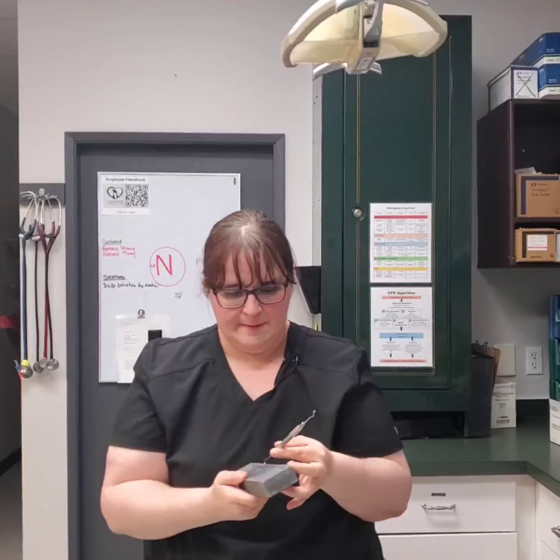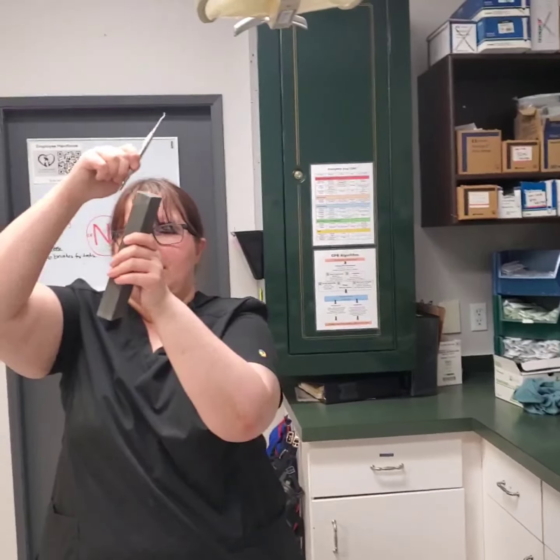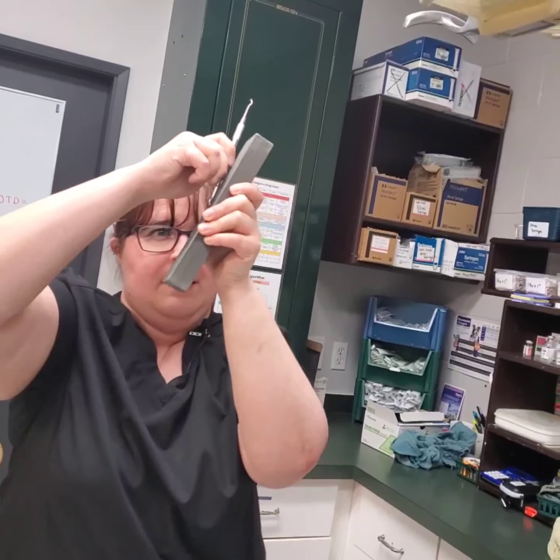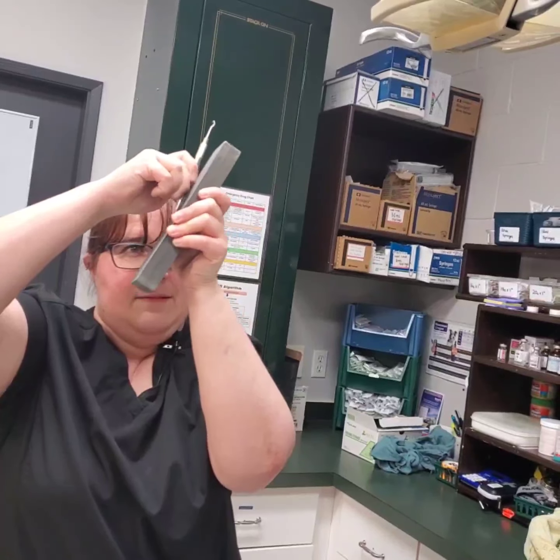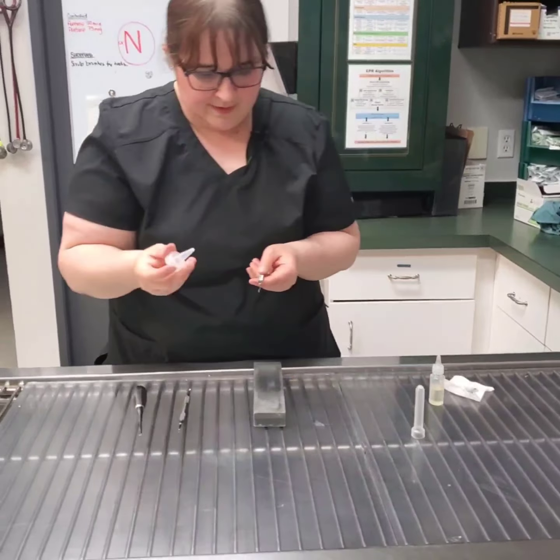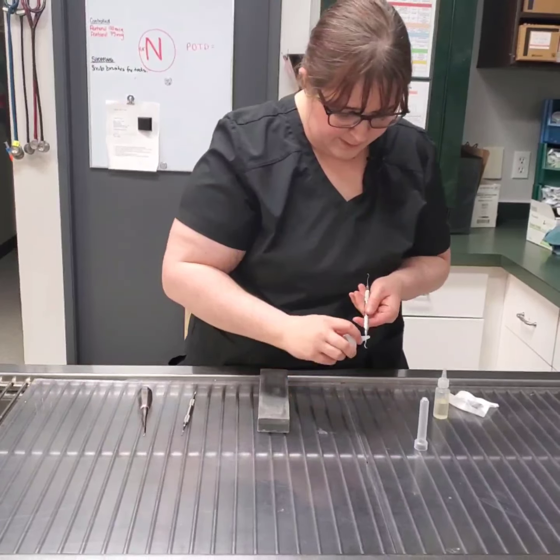Moving that to that angle. And then there, lining it up with the 11. That angle there. Ending on the downstroke. Taking my pretend conical one, getting rid of any burrs.